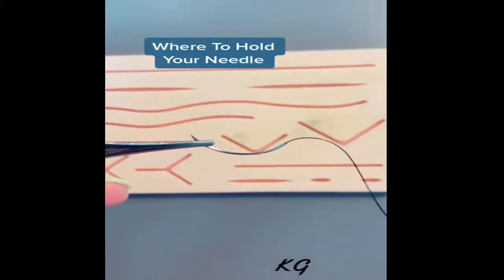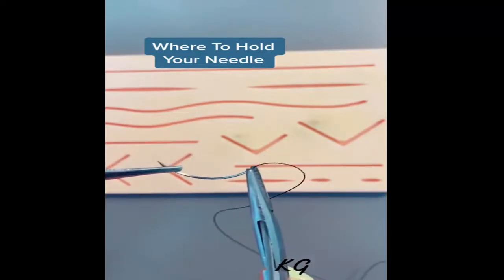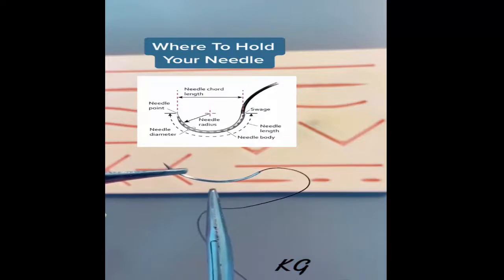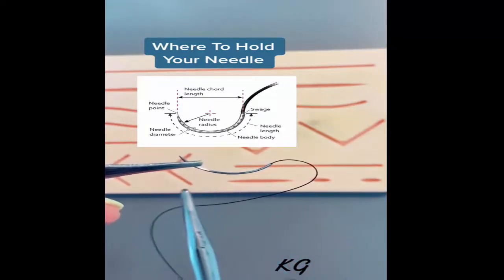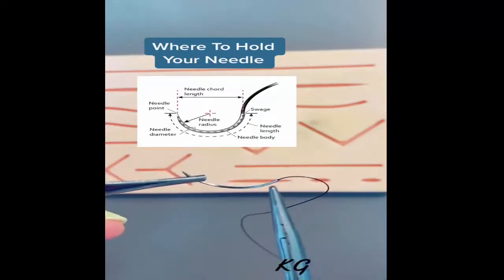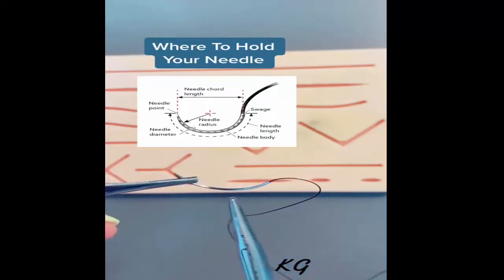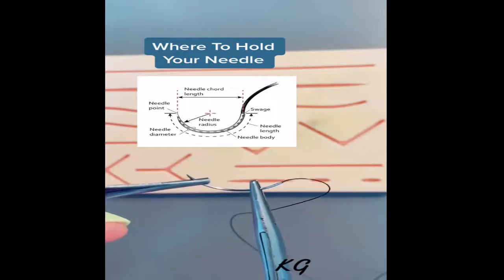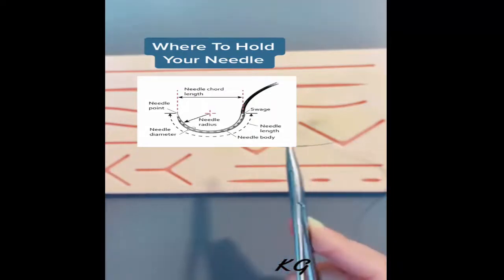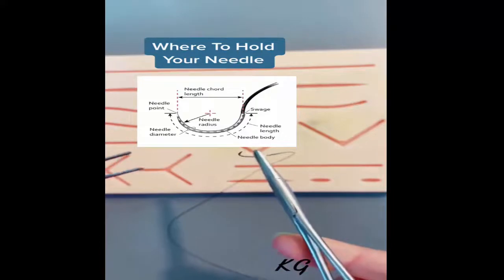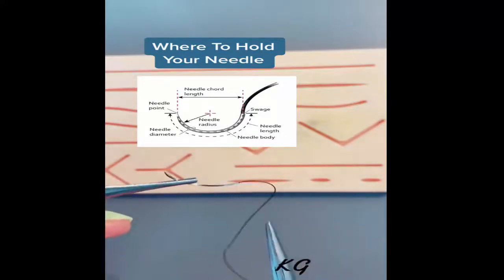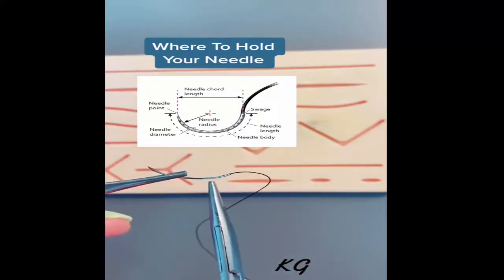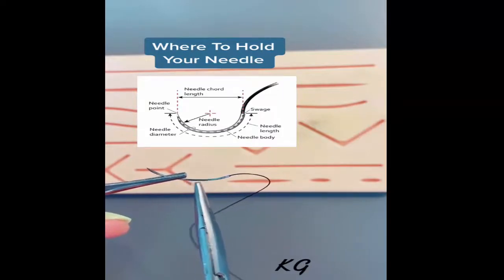Let's talk about where you should hold your needle with your needle driver. You do not want to hold it at the swage—that's where the suture and the needle connect. And you don't want to hold it right in the middle because that's not going to give you enough clearance to really flick your wrist and put in your suture. You want to do it in the middle of those two, right at the apex between the swage and the middle of the needle, right where I'm pointing. That's your sweet spot. That's going to give you room for motion and it's not going to bend your needle like if you hold it at the swage.